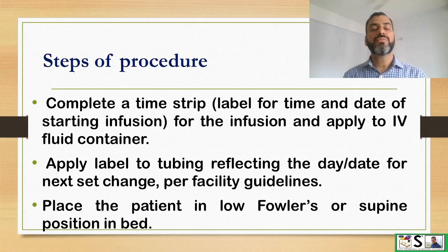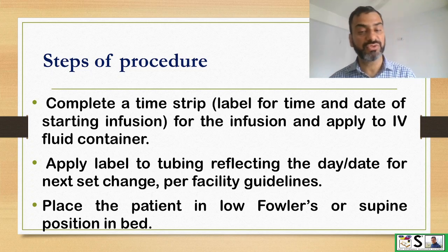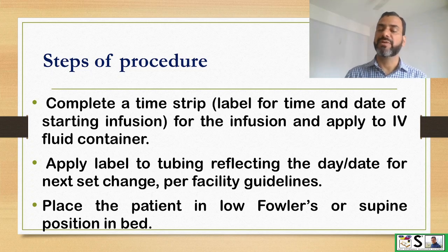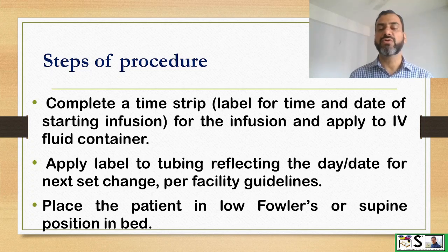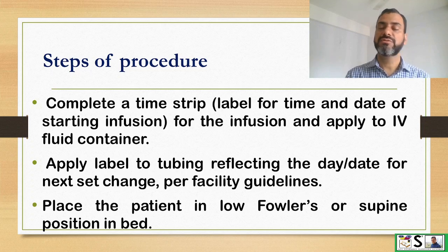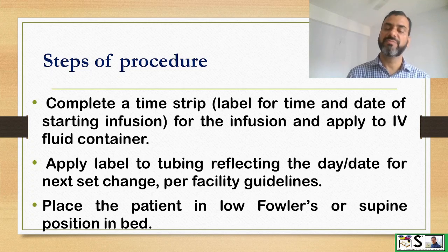Now we make a time label. We will label the time and date for starting the infusion and apply it on the IV fluid container. Also apply a label on the tubing reflecting the day and date for starting and for the next change, depending upon the hospital's policy.